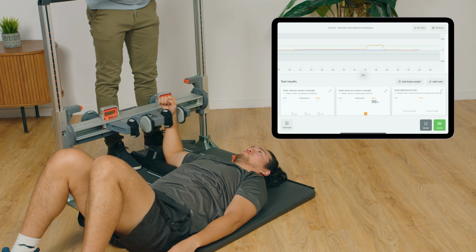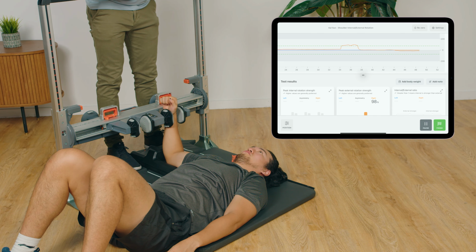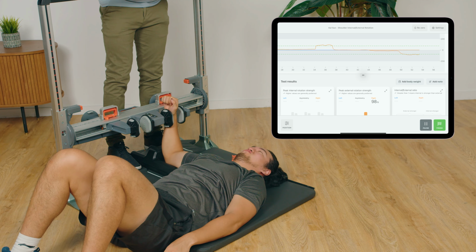Now, gently place your hand in contact with the pad below you for internal rotation here. And 3, 2, 1, go. Push, push, push, and relax.